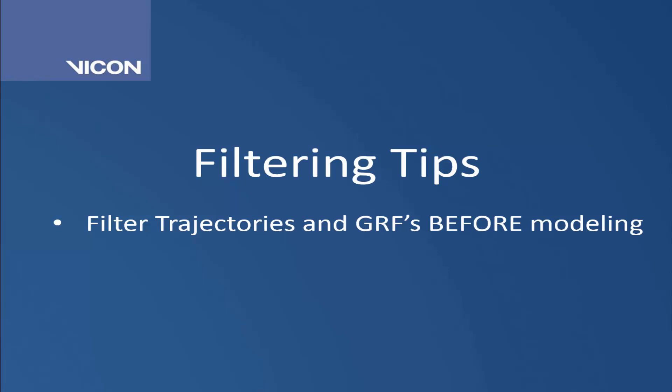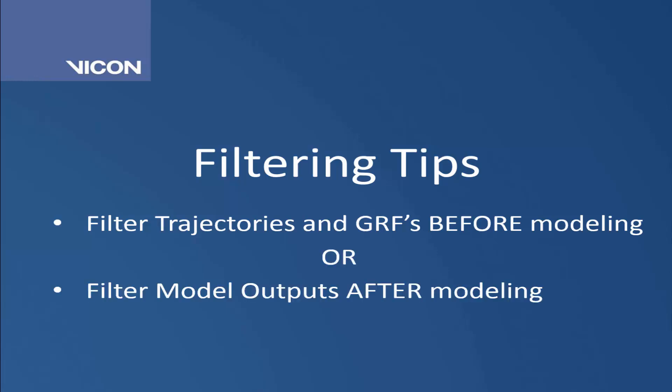Secondly, the order in which you use the filters matters. Generally speaking, you would filter your trajectories and your ground reaction forces before modeling your data. The alternate is to filter your model outputs after you've modeled your data. You would do one or the other. You wouldn't filter your trajectories and your ground reaction forces as well as your model outputs.